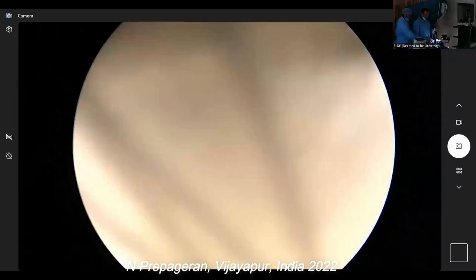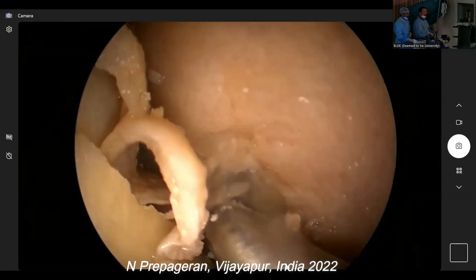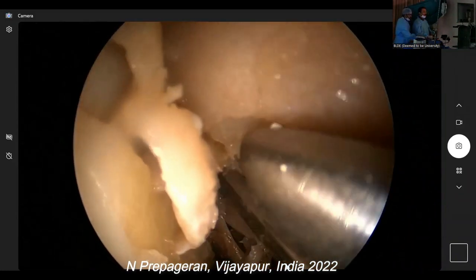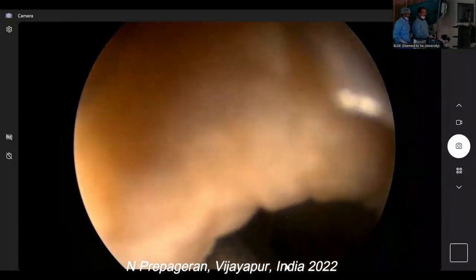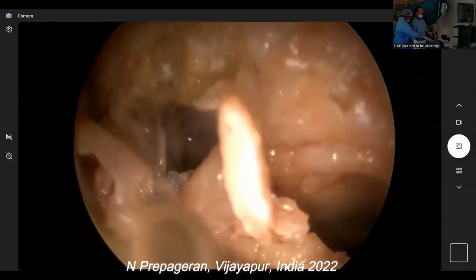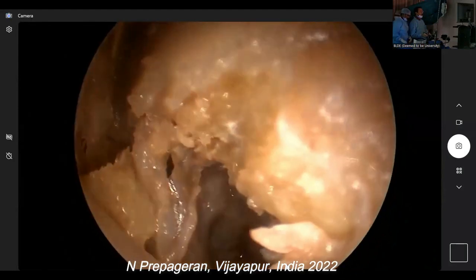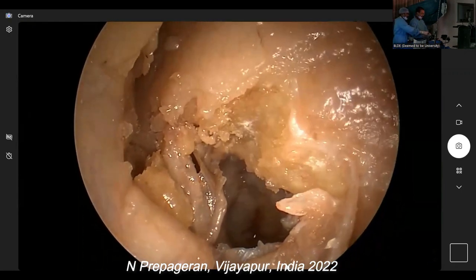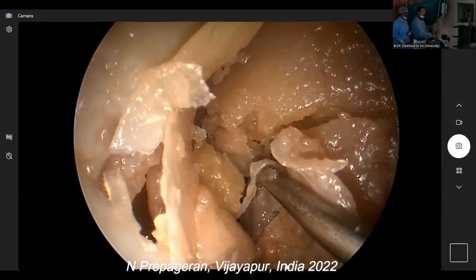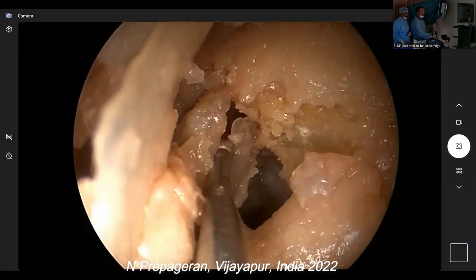Okay, crescent punch. The problem is we don't have a frontal set. So remove the agger nasi. As you remove the agger nasi, your frontal will come into view for you, if this patient has got a frontal, that is. Correct? Ball probe? So now, after we remove that, this is your frontal. Can you see, guys? Okay.